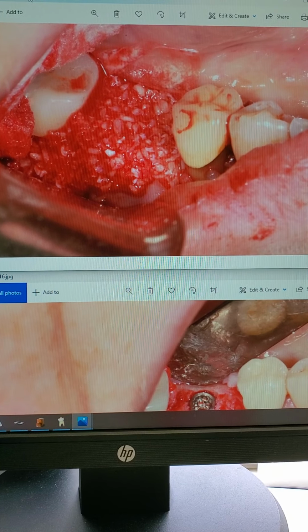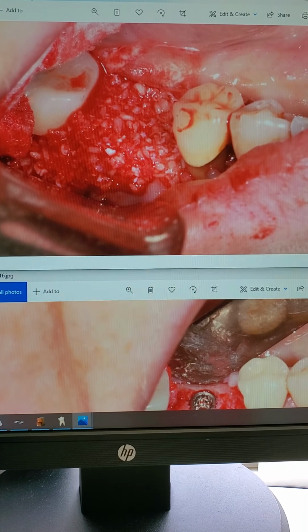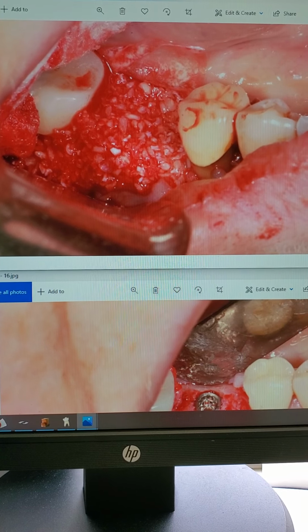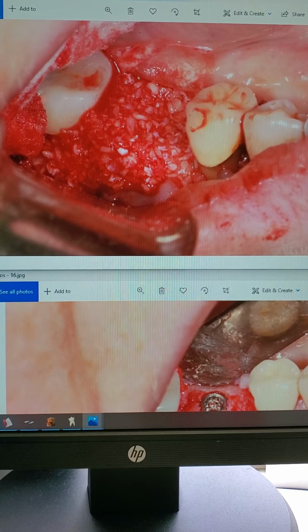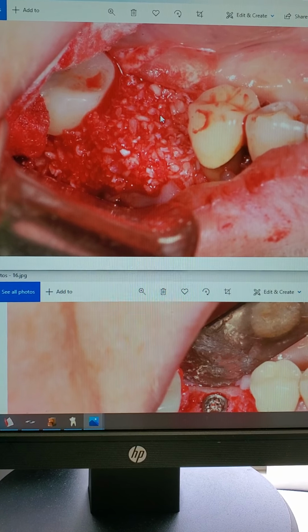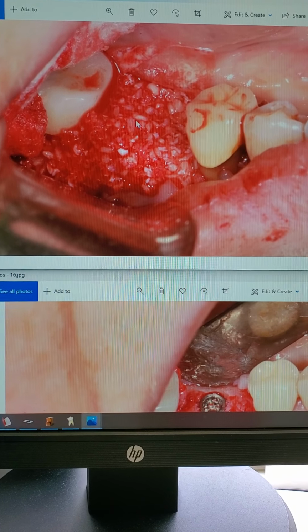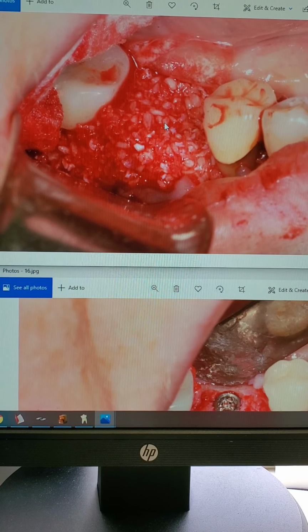Especially now, remember, when you're dealing with a site which has teeth versus an edentulous site. When there are teeth involved, it can be more challenging. Why? Then you have to see how your flap is going to remain tightly closed, how you're going to suture it. Okay. So a few things to notice. One, we have particulate bone, so the blood supply will be faster versus a block graft. And there are scrapings, autogenous scrapings in there, not too much, okay?